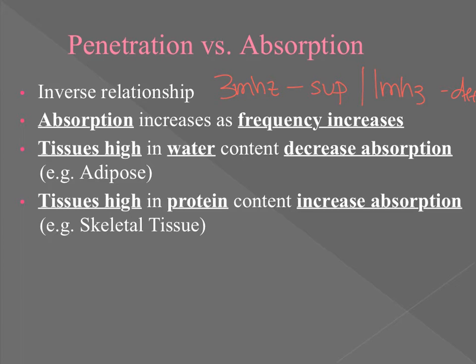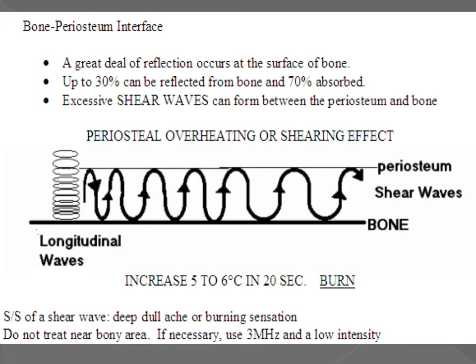So penetration and absorption, we have to think about that from a frequency standpoint. If it's a high frequency treatment, the superficial tissues are going to absorb it. If it's a low frequency treatment, then those deeper tissues are going to absorb it a lot more. So let's take a look at this image here.